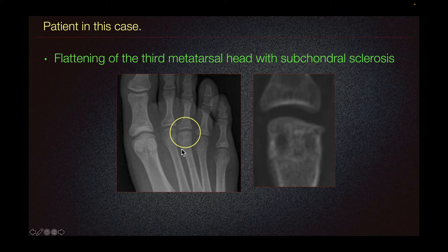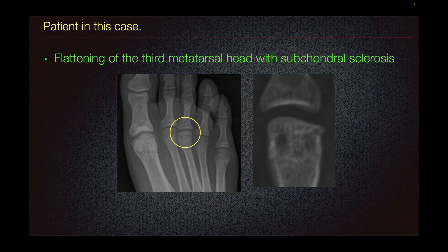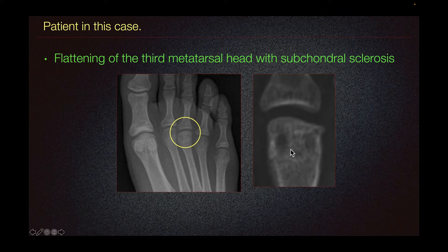In this foot radiograph, we can see flattening of the third metatarsal head with subchondral sclerosis as seen here. On magnified view, we can also see subchondral cystic changes in the third metatarsal head.